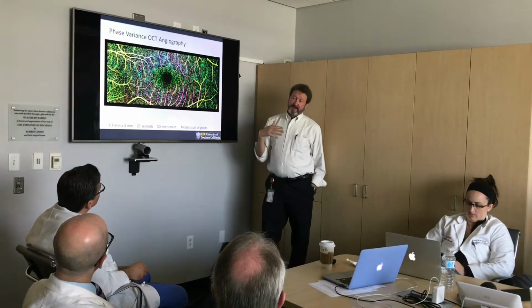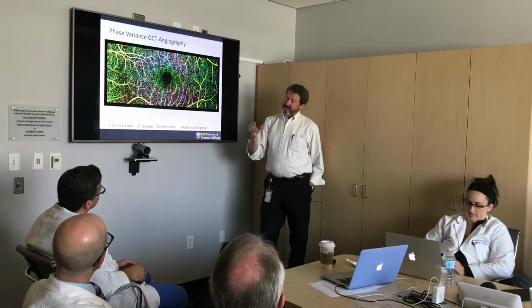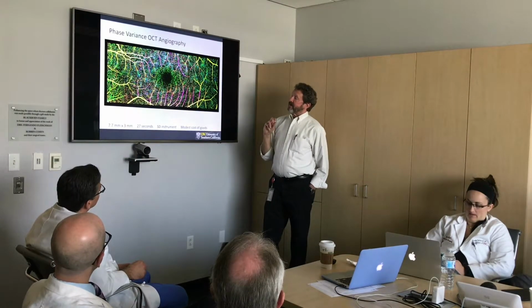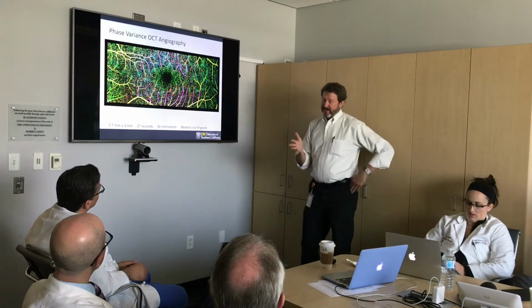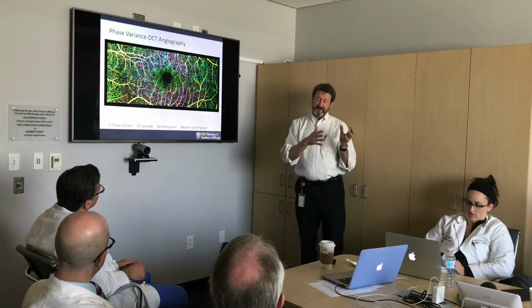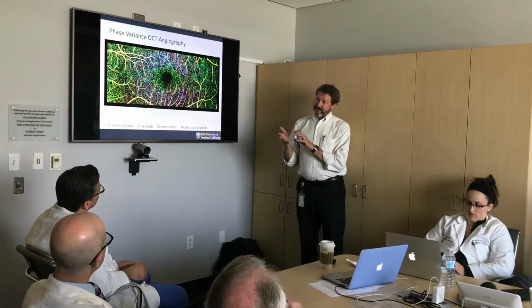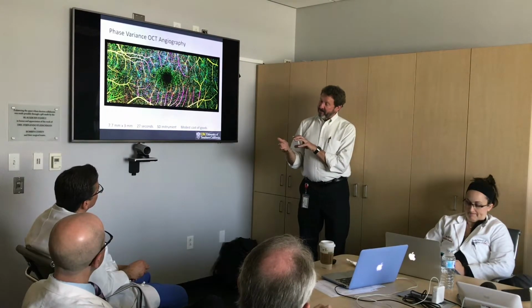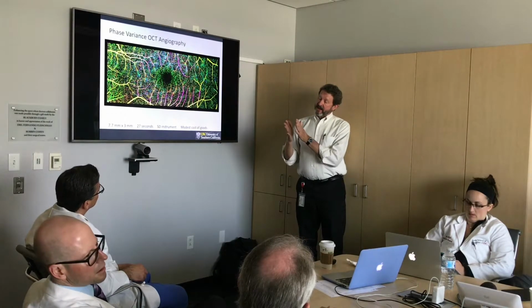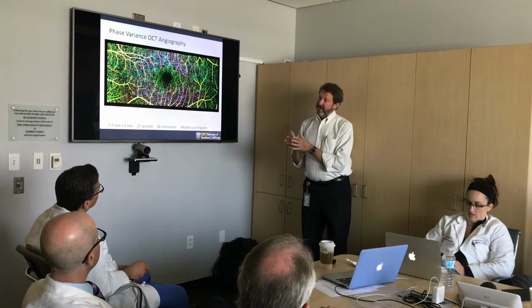And what we would love to do on the vulnerable plaques is to look below the surface at the mobility of the scatterers. And what we've been seeing in inflamed tissue versus cells that are starting to execute the cell death cascade, and a number of other settings, is at least a surrogate marker in the mobility of the scatterers. I've been very interested in the vulnerable plaque question, if we could see structural features that normal OCT or ultrasound are a little bit blind to.